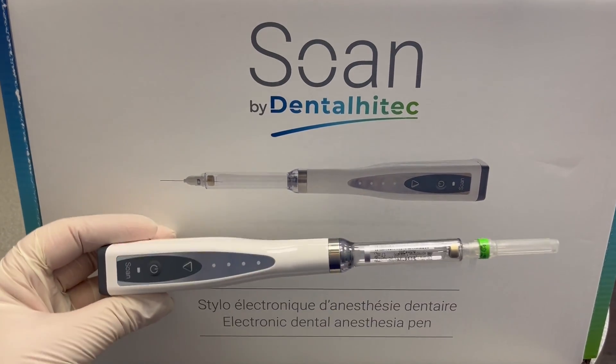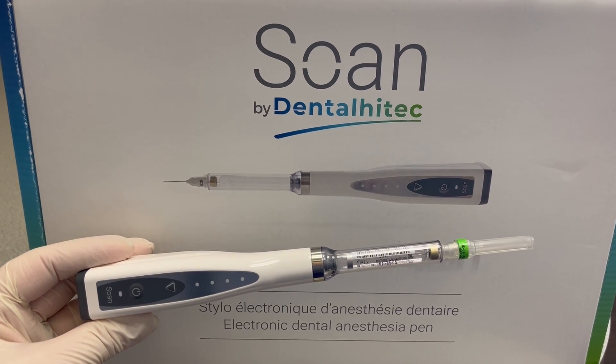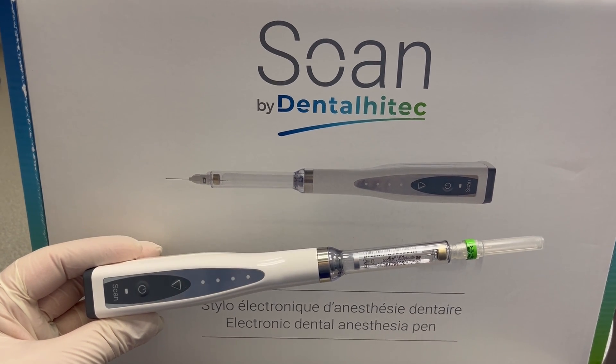Welcome to Soan Show and Tell. I'm going to show you my new electronic dental anesthesia device, which was designed and manufactured in France by Dentalhitec and now distributed in the U.S. by Newsmile.